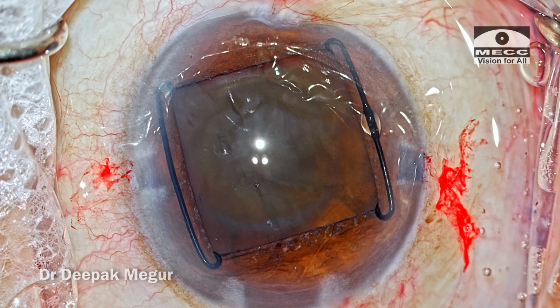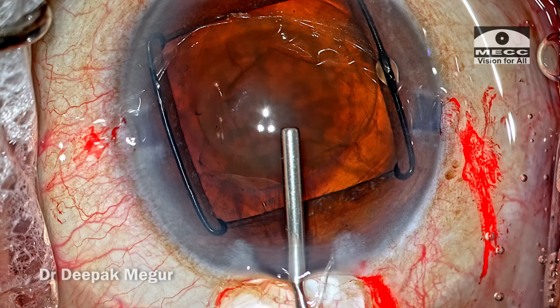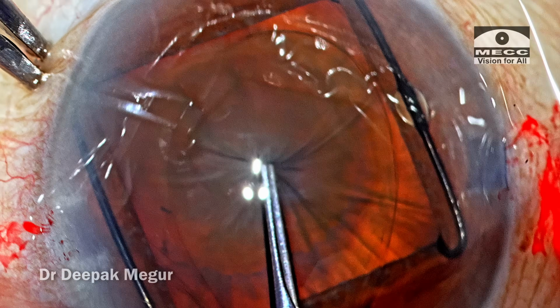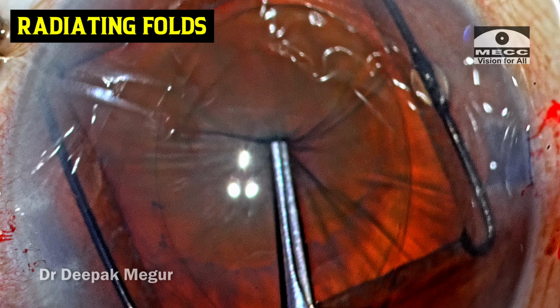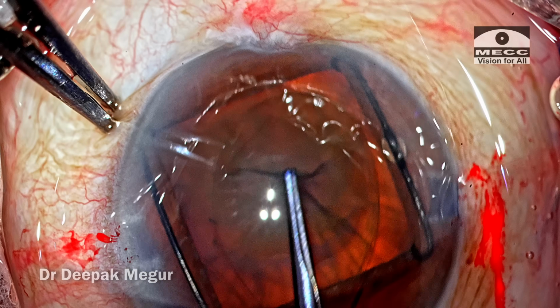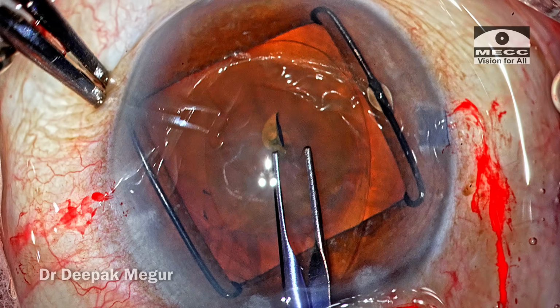So this is the time when I would actually come to know the health of zonules. The moment I touch the capsule to puncture with the forceps, I can see these radiating folds emanating from the point of contact, and this is surely suggestive of a loose bag with lax zonules. With a little bit of pressure, I could puncture the capsule.